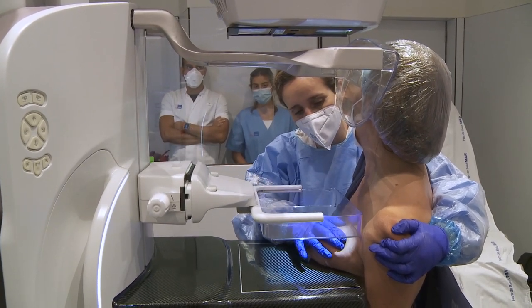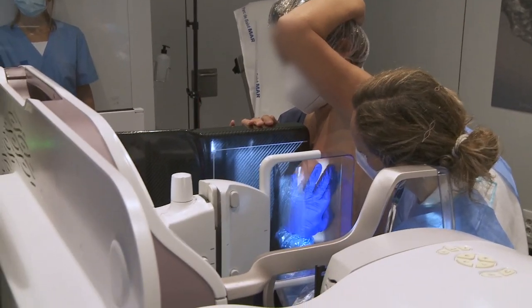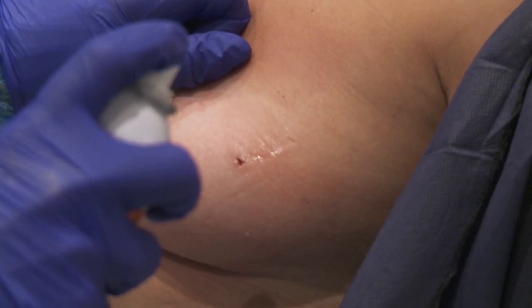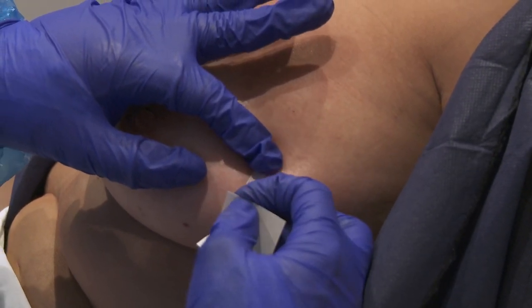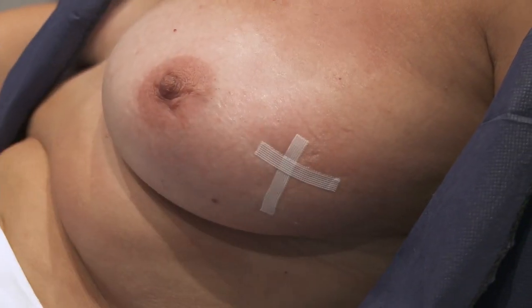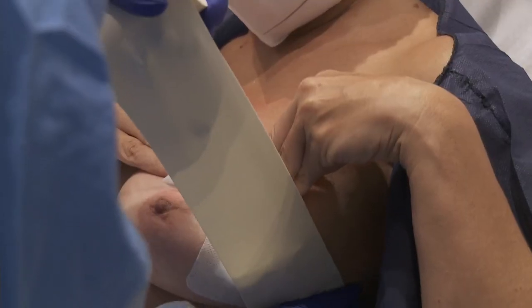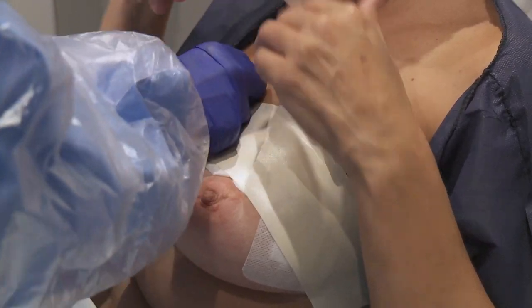Routine CC and ML views are carried out to check the tissue marker placement. The entry point is covered with closure strips and a gauze. Additional gauzes are placed on the biopsy area for tighter compression and a compression bandage added, which must remain in place for 24 hours.